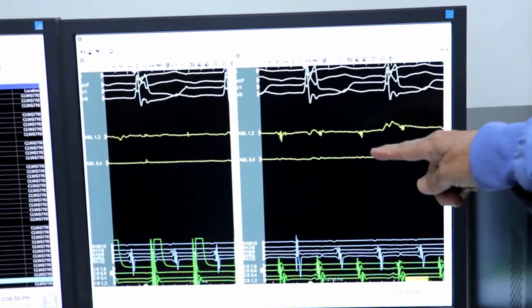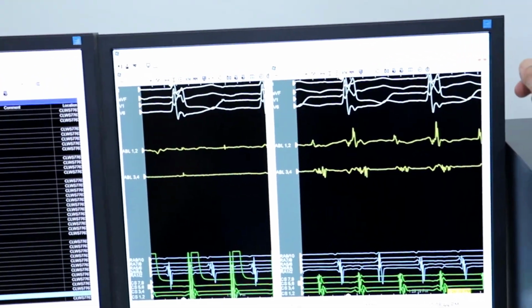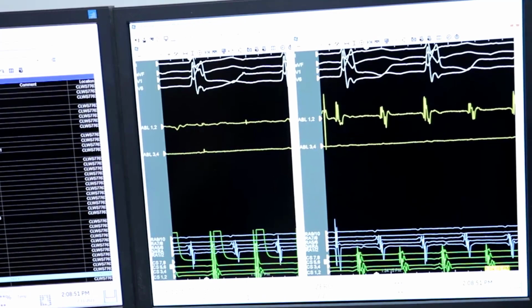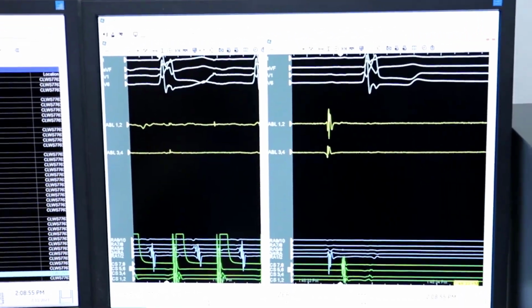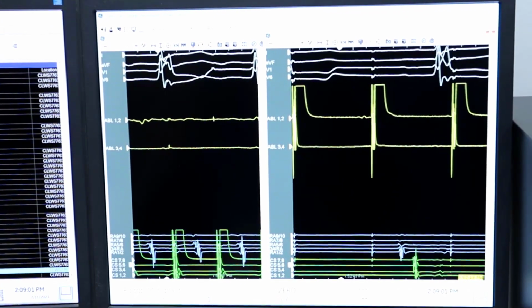This is the second tachycardia, the previous one. The second, the flutter, is a counterclockwise atrial flutter, and we proved it by PPI, by pacing from the isthmus, and we proved it is isthmus-dependent atrial flutter. I was just looking at the right atrium.